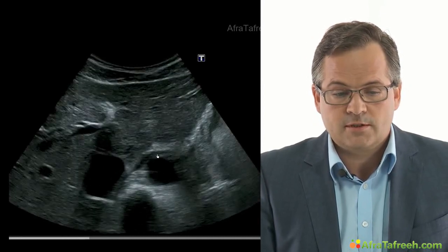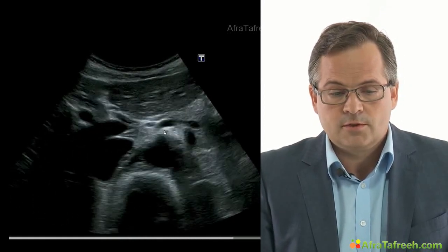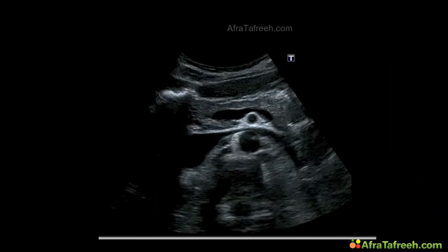Once again, in the video, over here, splenic vein, renal vein, and the IVC right side of the aorta.